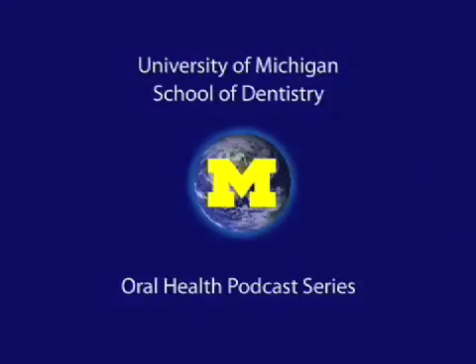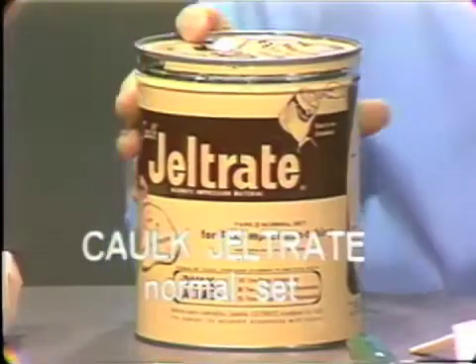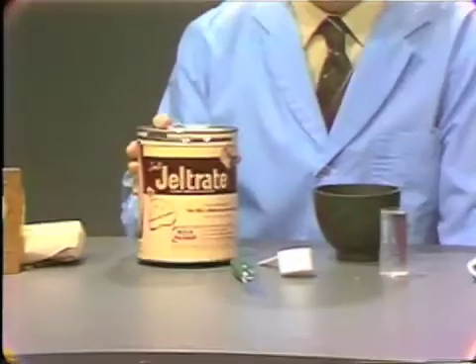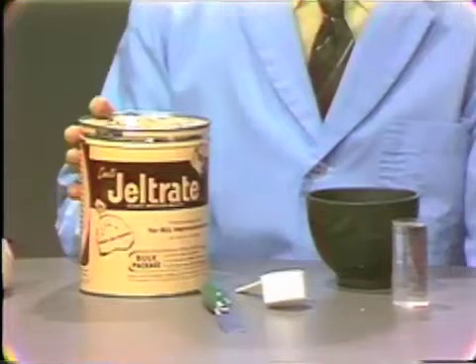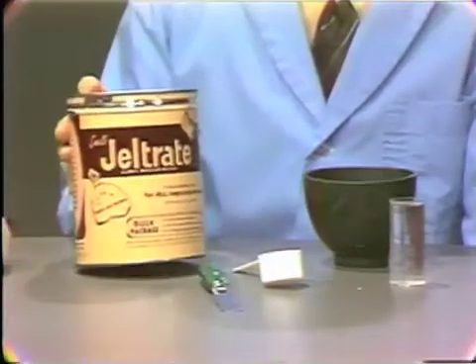Welcome to the University of Michigan Dentistry Podcast Series, promoting oral health care worldwide. Jeltrate is supplied in a powder, and in general is supplied in a large can such as this. It also is supplied in pre-weighed packages in foil, but the most common packaging system that you will find in the dental office will be this large can.